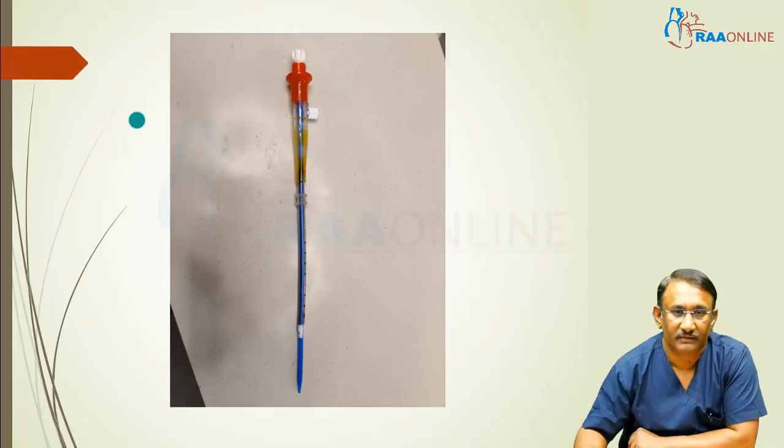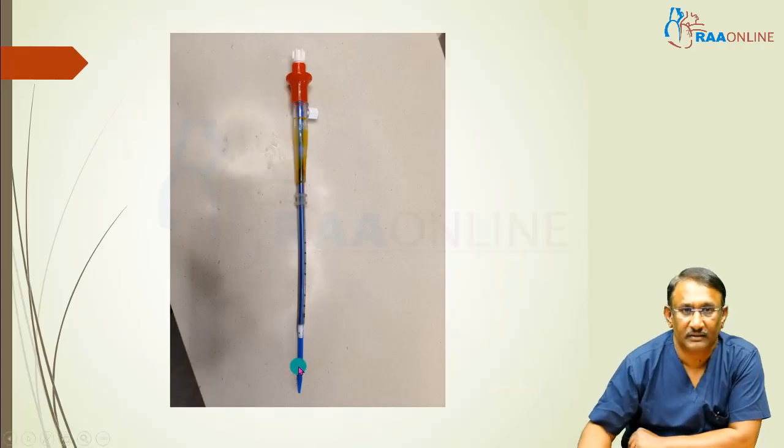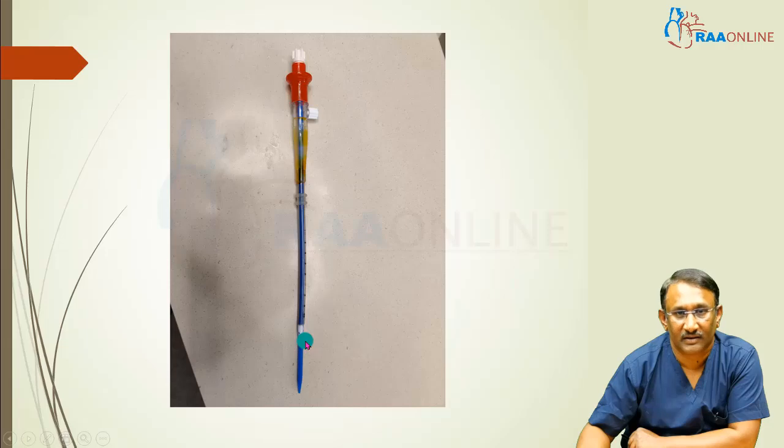This is the other type of cannula, which is used for return. The other one we saw previously was the drainage. These are used for return. When you say return, you are using it on the venous side for a VV ECMO and the arterial side for a veno-arterial ECMO. What is the difference? The difference is you don't have multi-hole drainage in them, or multi-hole return. Usually you have holes only at the tip. At the maximum, another set of holes may be there just a little short of the tip. Otherwise, you don't have holes at the entire level.